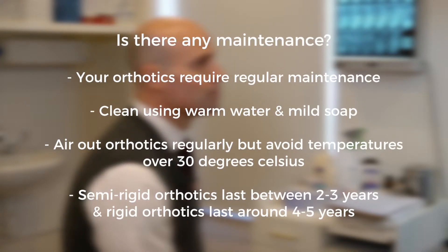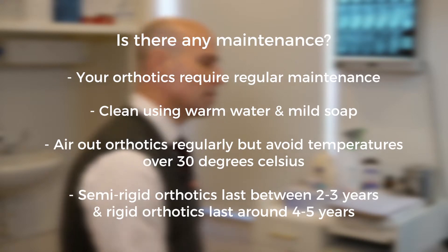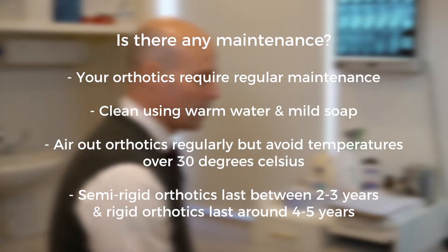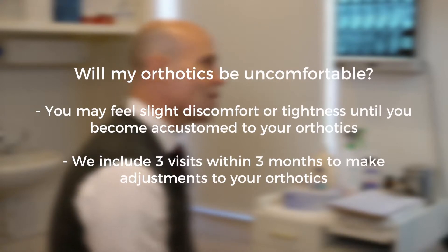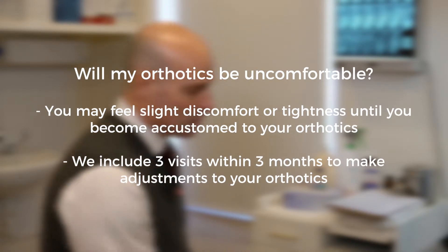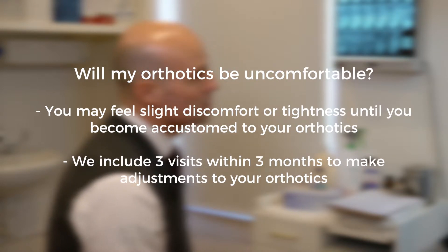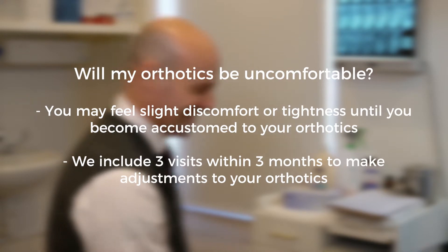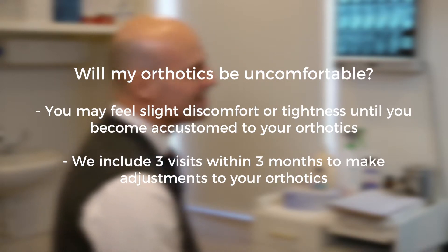Is there any maintenance? Your orthotics and feet need regular maintenance. To clean your orthotics, use only warm water and mild soap. Air out your orthotics regularly but do not dry them in heat over 30 degrees. You must return for regular visits as advised by your clinician. You may feel slight discomfort or tightness until your feet become accustomed to your orthotics. If discomfort is too great, rest your feet from the orthotics and avoid impact sports, long runs, or walks. For full custom orthotic therapy, we include up to three visits within three months to make adjustments, as part of your comfort and care guarantee.